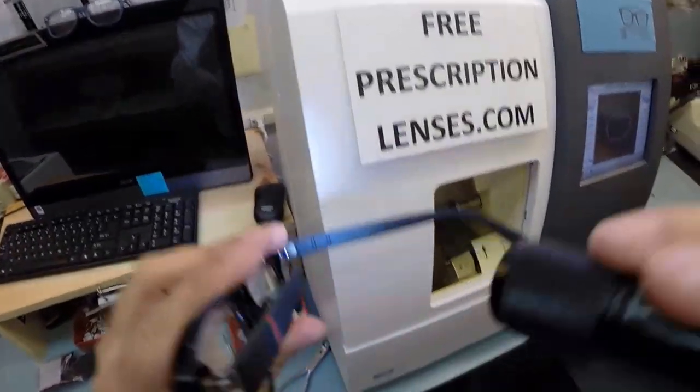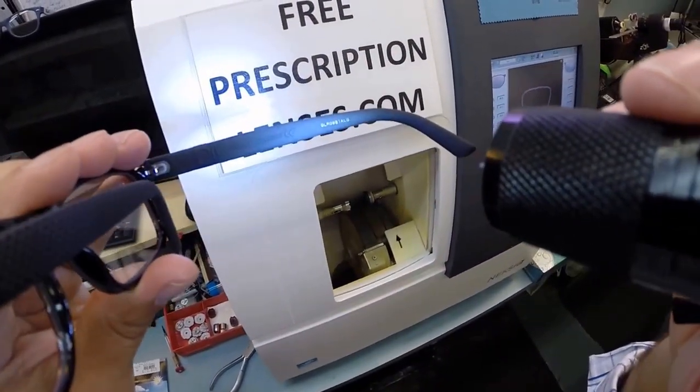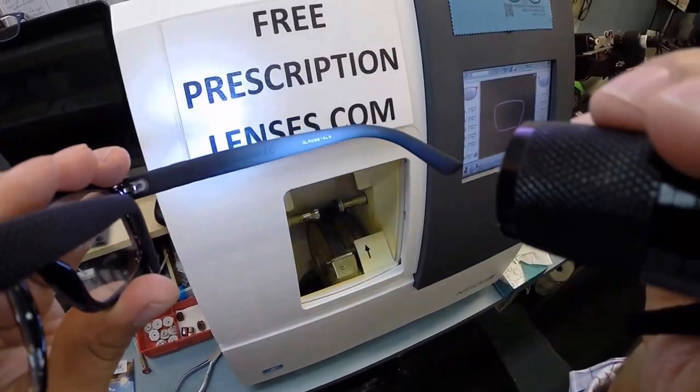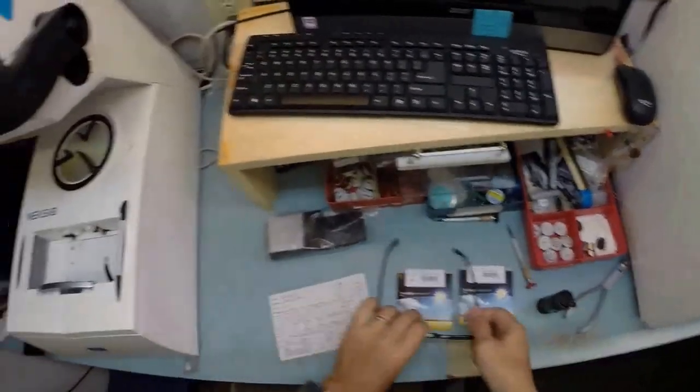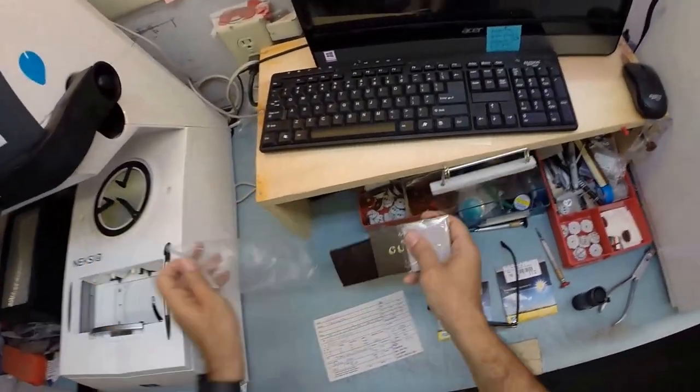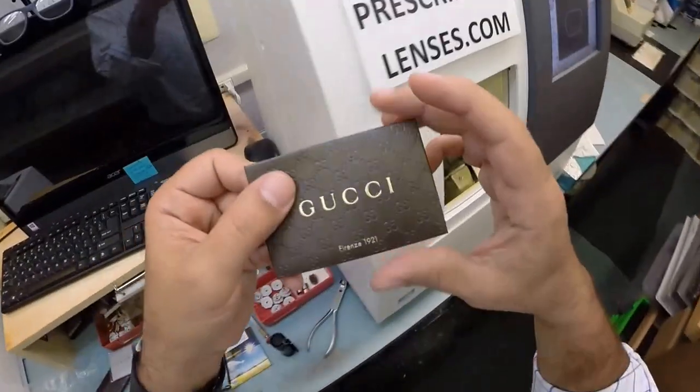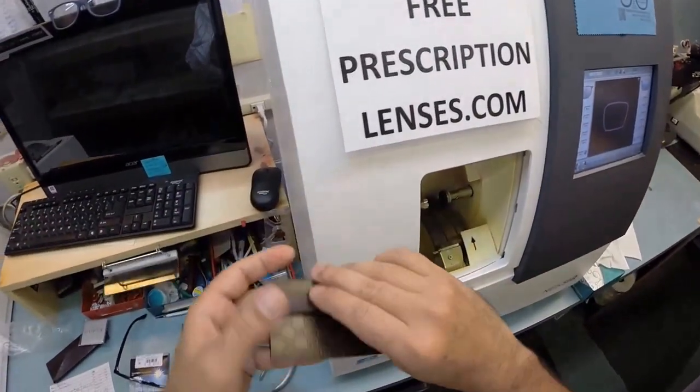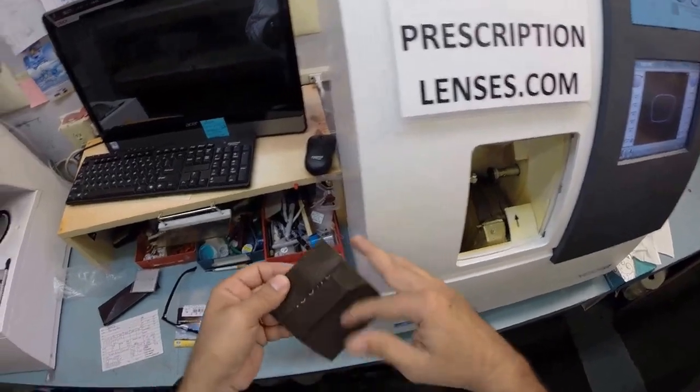Of course all Guccis are made in Italy. Right there is your serial number that you can register your product with Gucci with your card of authenticity, your COA as it's referred to. Let me open that up.